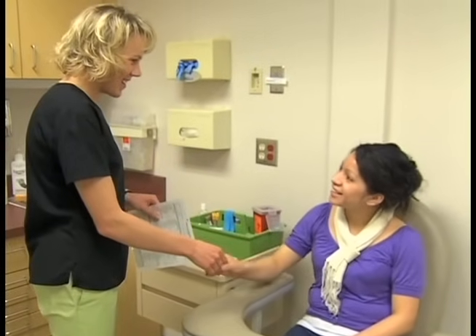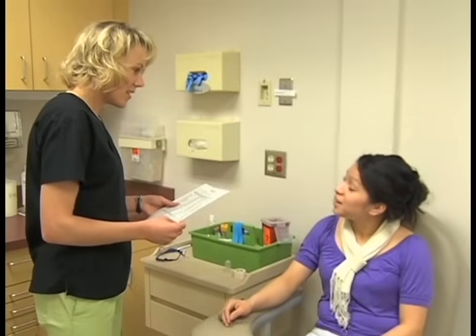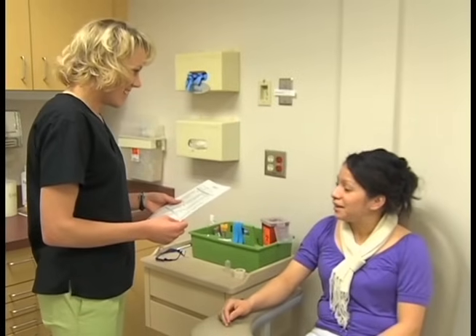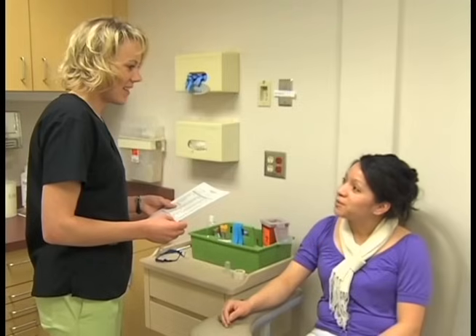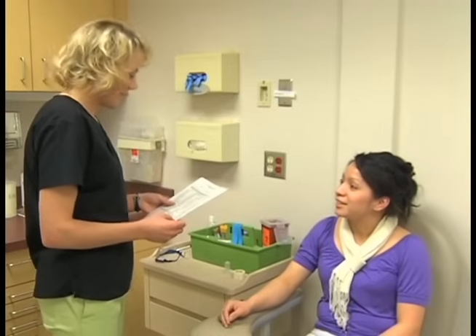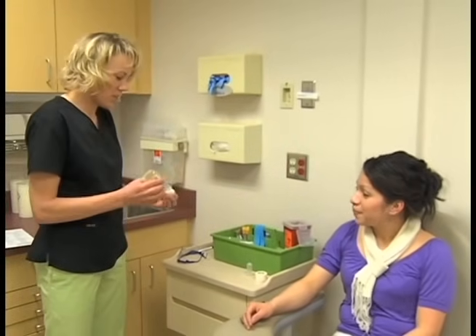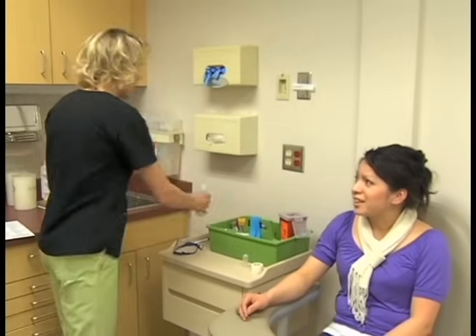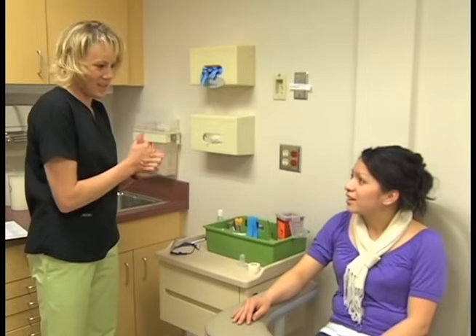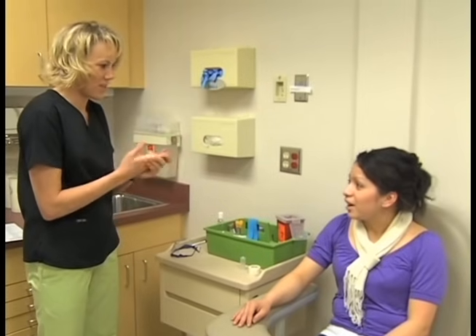Greet the patient and introduce yourself. Identify the patient by asking them to state their full name and date of birth. It is important to confirm that you have the correct patient to avoid collecting a specimen on the wrong patient. Compare this information to the information in the patient's chart. If the patient was required to prepare for the test with fasting or medication restrictions, determine whether he or she has prepared properly.